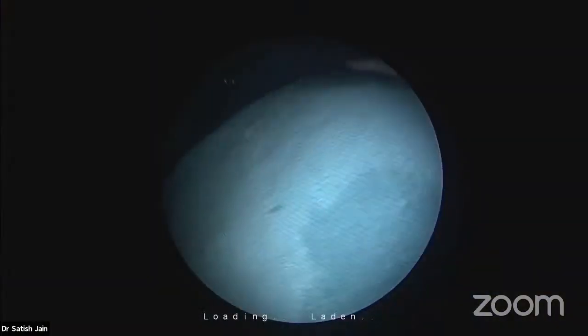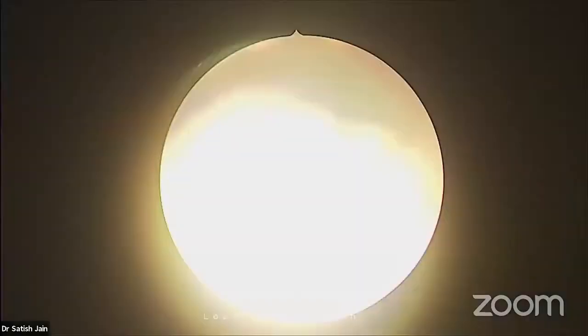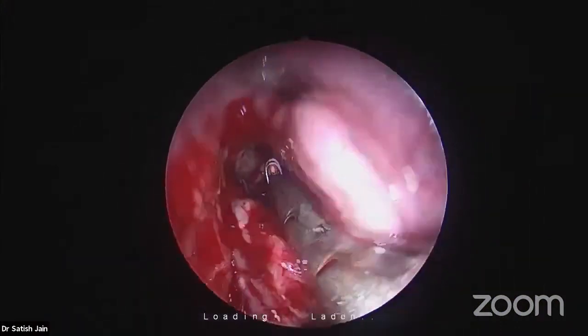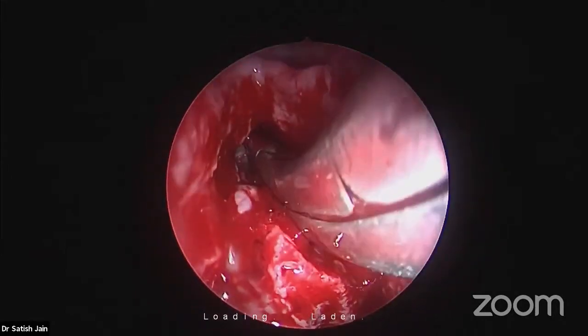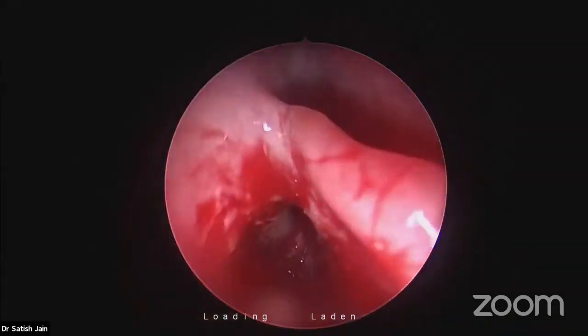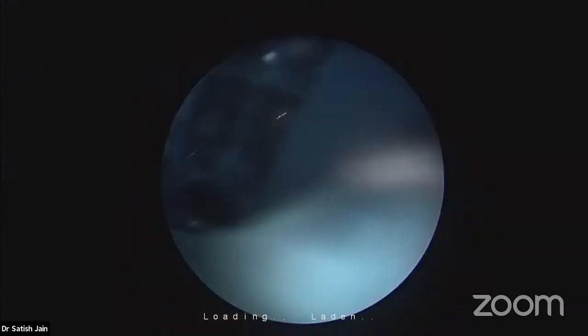I am removing this beak with this special instrument. What kind of special instrument, what are the curvatures and what is the crossover phenomenon during surgery? This is an amazing tool from Karl Storz. See this. See the frontal thoroughly.